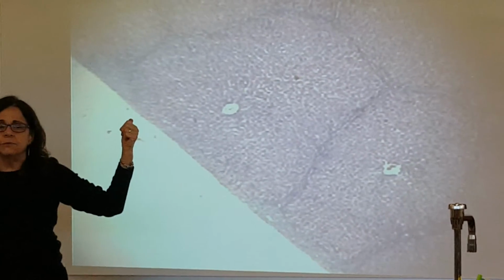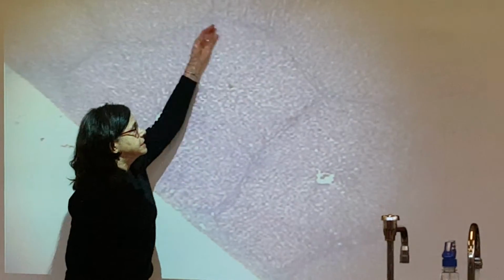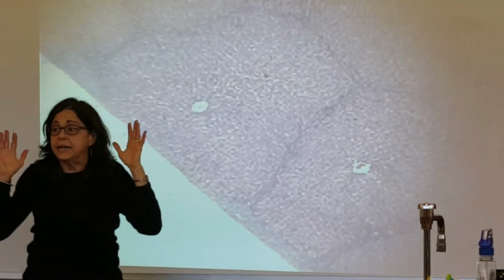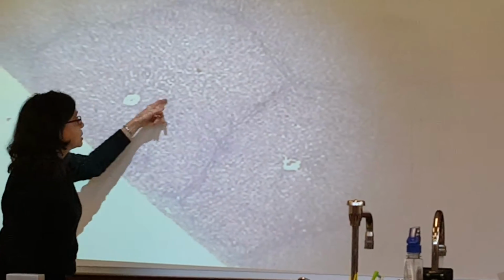So you're good with that? You recognize liver, right? And you should know central vein, and then this is a lobule, and to know the idea that those hepatocytes will be cleansing the blood that's traveling through them. Good. You're good with that. Okay.